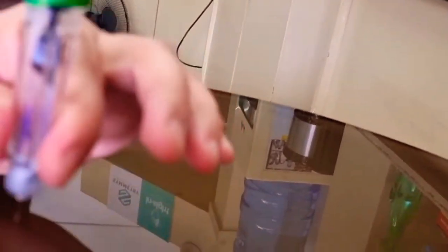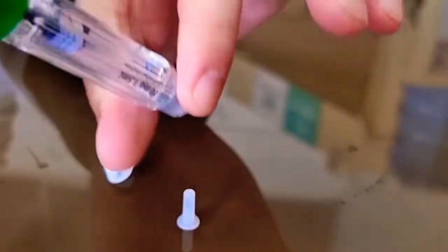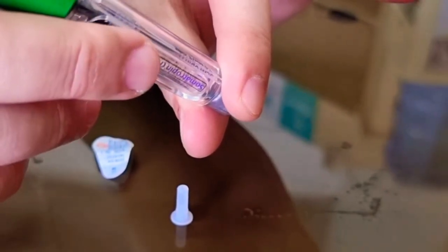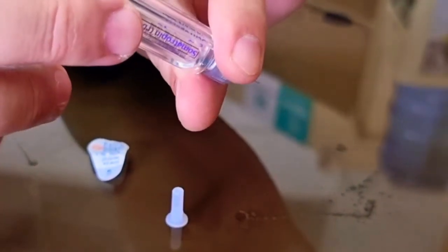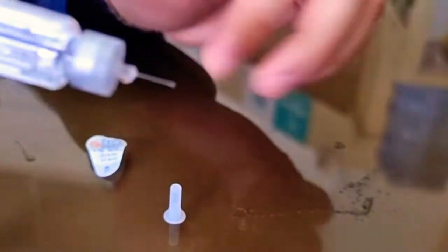A couple of clicks. So this should be in. Same as before, and you'll tend to feel a cold sensation while there's dispensing of the drug, right? If it's from the chiller. Then just leave it there because there's a little bit of a drift. And 10 seconds, then you can pull out and clean up.